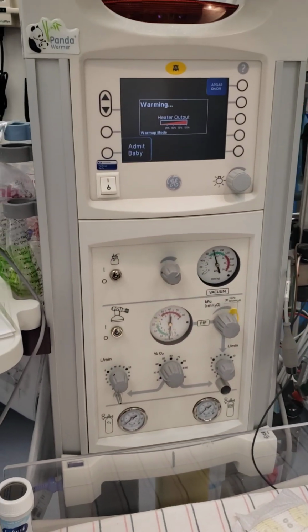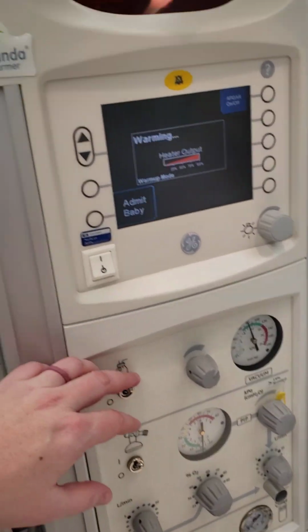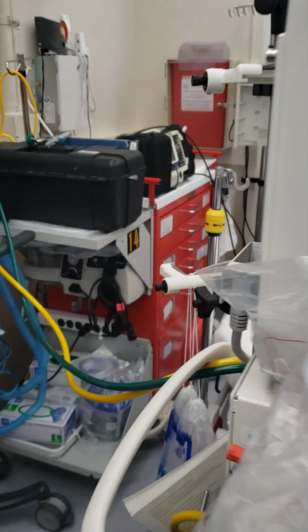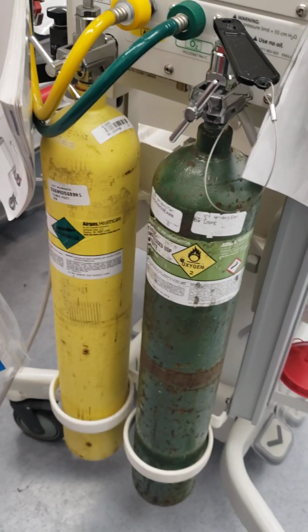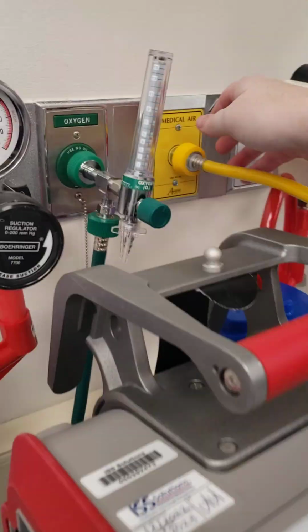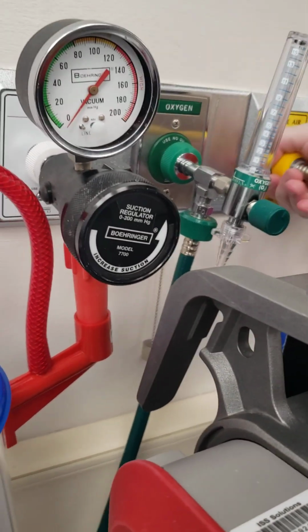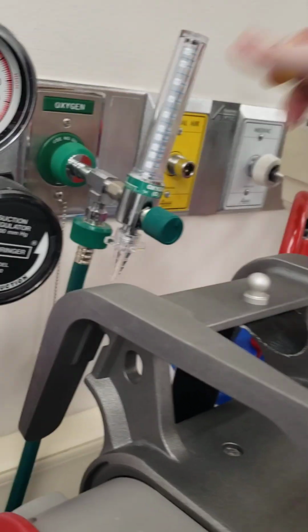If you, for some reason, didn't have access to the wall suction, or to the wall air or oxygen, you can still resuscitate this baby. We have our tanks on the back here. Now I'm going to disconnect these again real quick, and I'll show you how to turn those on, because many times people don't realize how to do that part.